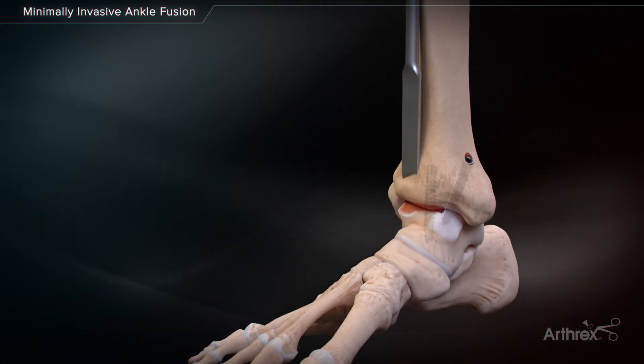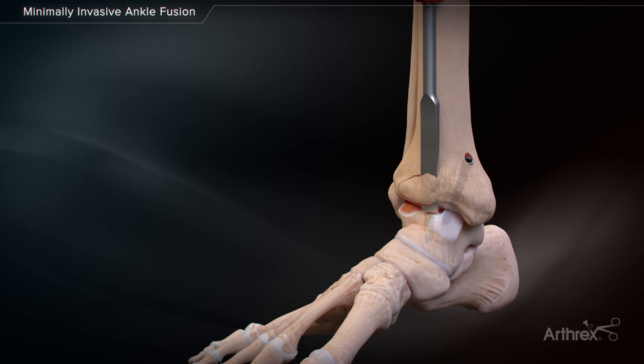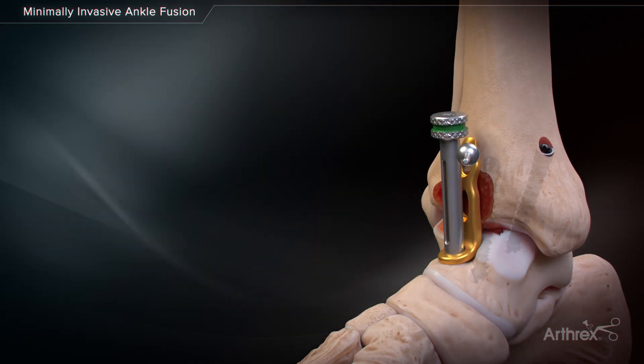Osteophytes on the anterior surface of the distal tibia may need to be removed prior to plate placement. Insert the minimally invasive ankle fusion plate through the extended medial portal using the locking drill guide as an insertion handle.